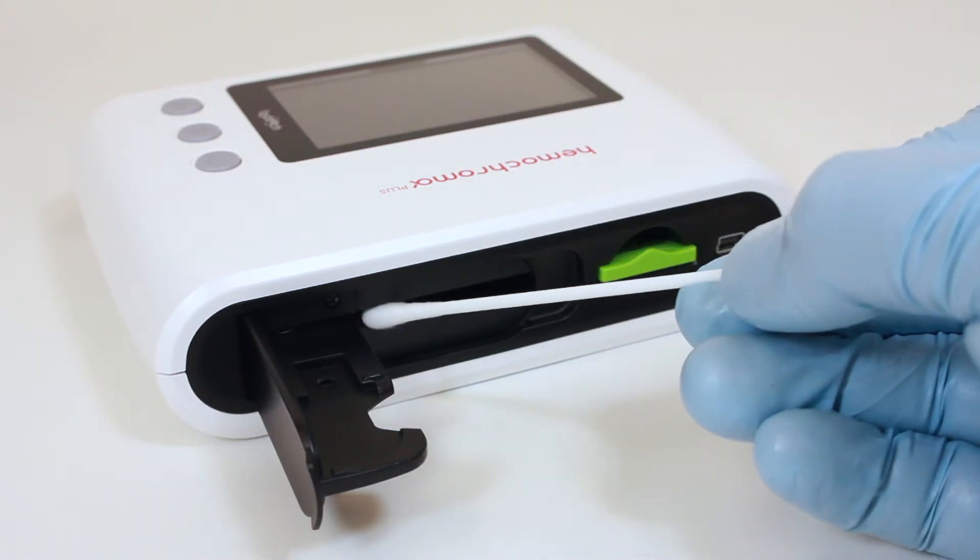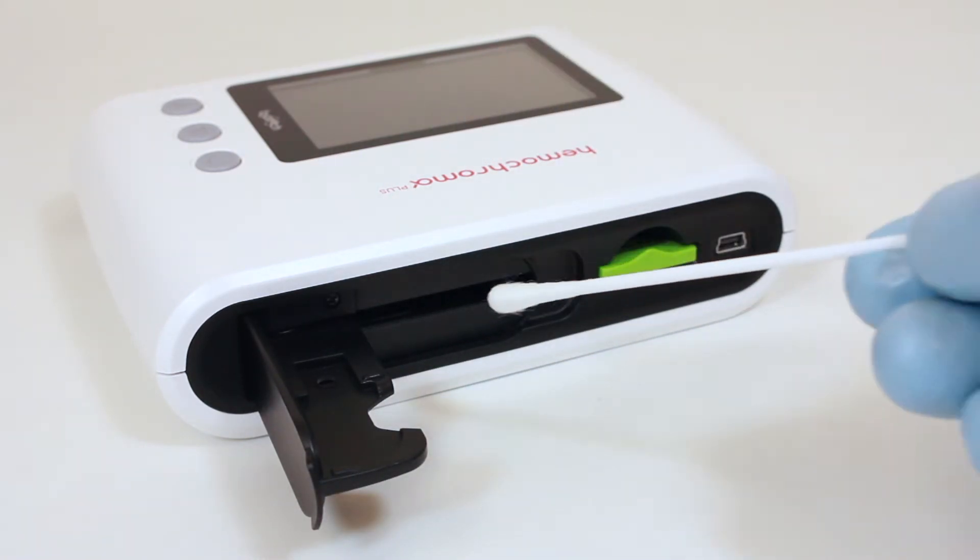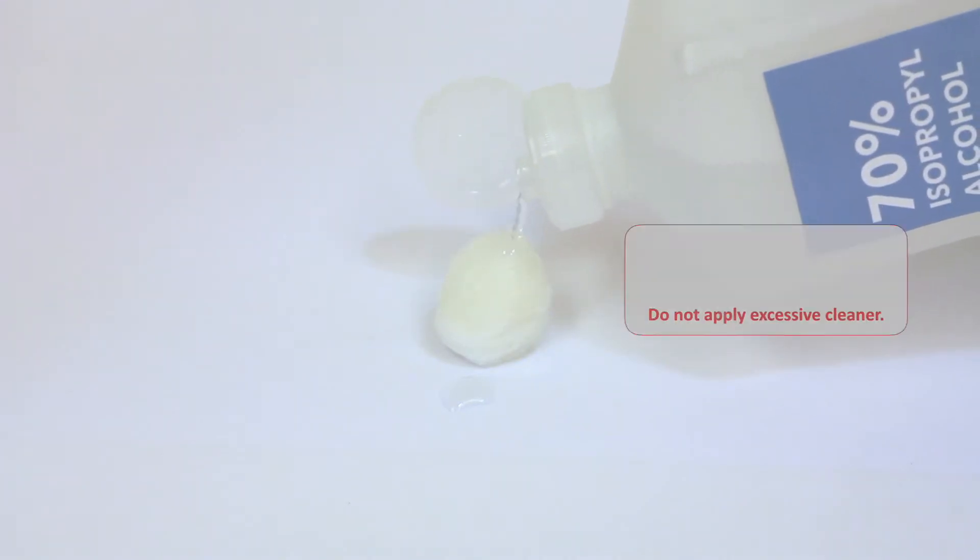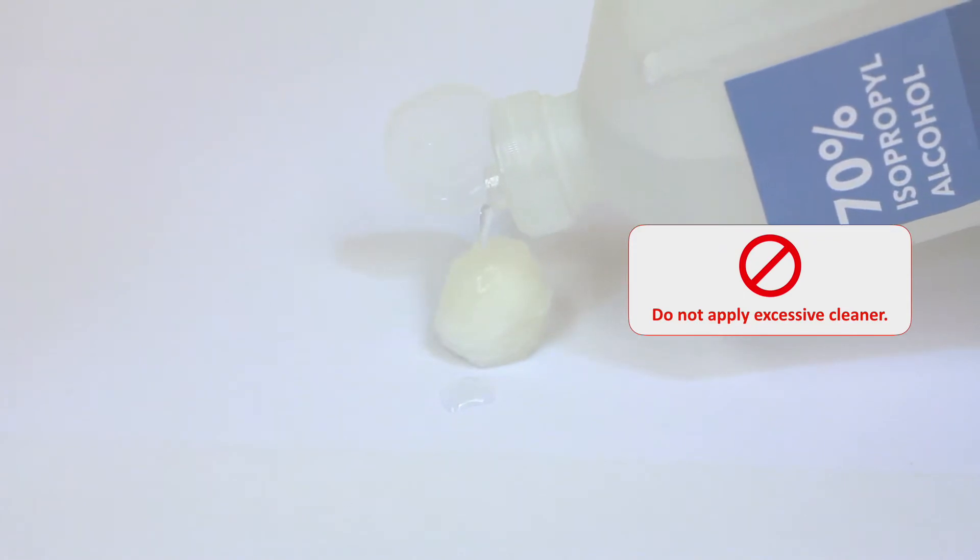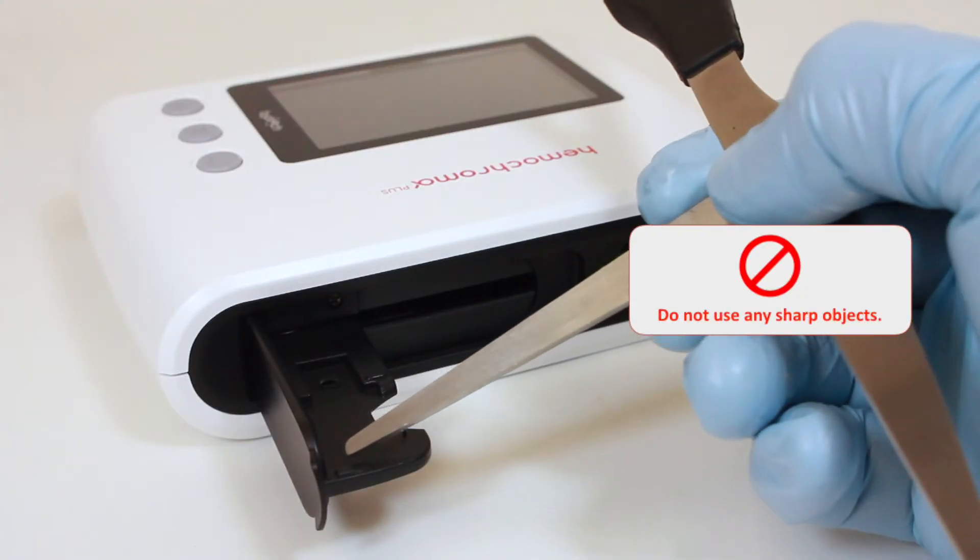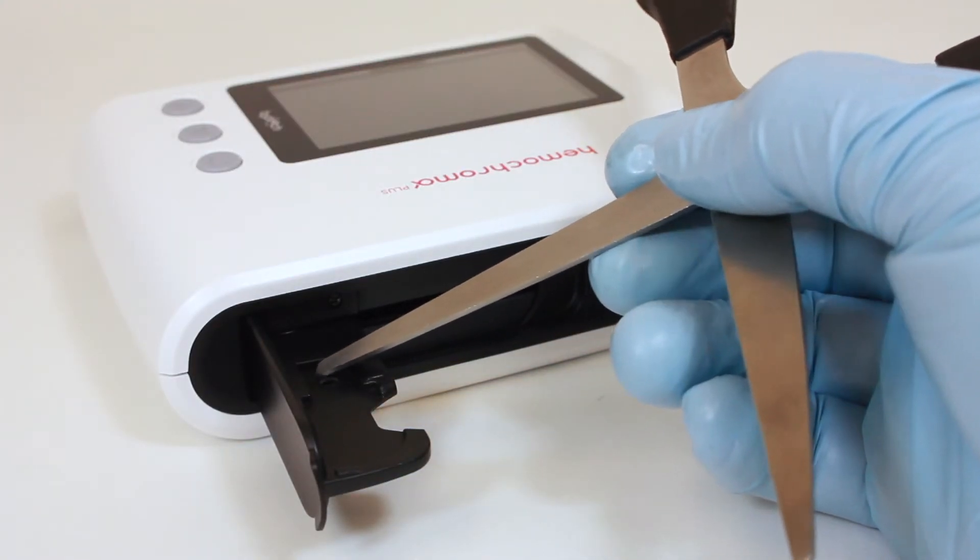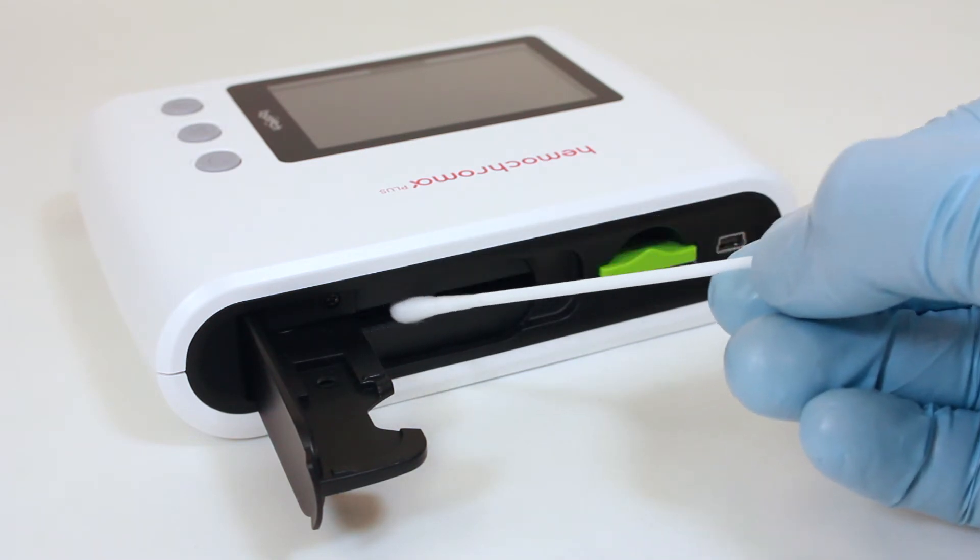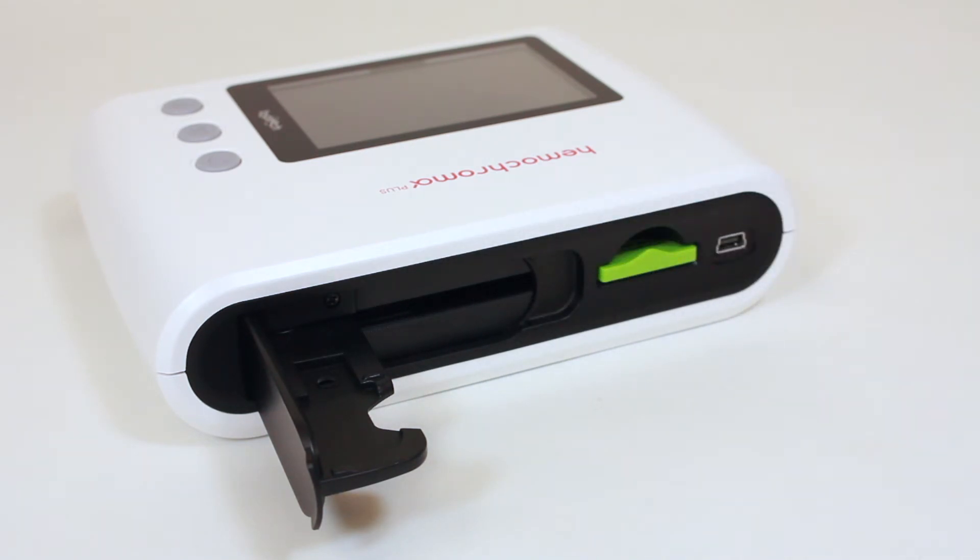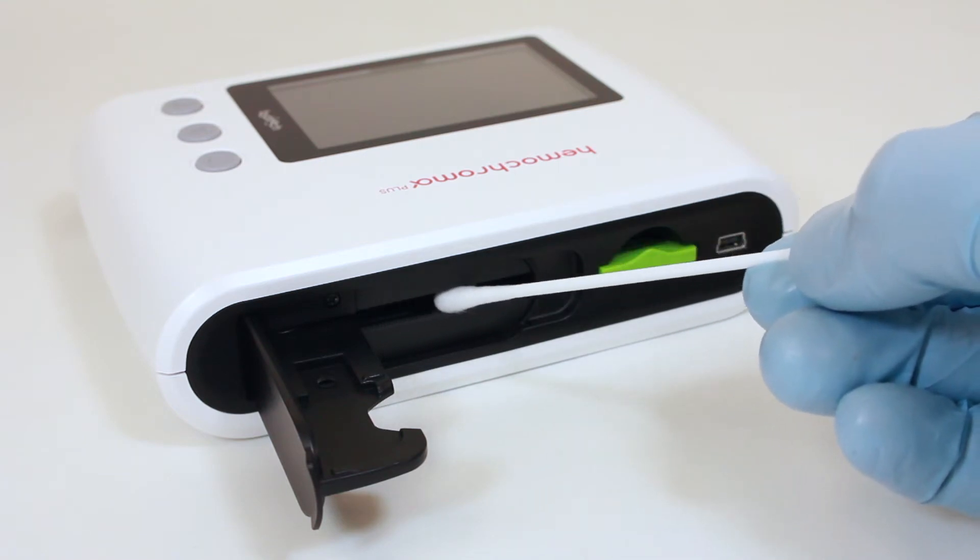Use a cotton swab dampened with 70% rubbing alcohol or mild detergent to clean inside of the sample holder. Do not apply excessive alcohol or mild detergent to the cotton swab. Do not use any sharp objects as a substitute for a cotton swab. Clean the holder and protective glass plate inside the sample reading slot. Repeat the process until no longer necessary.